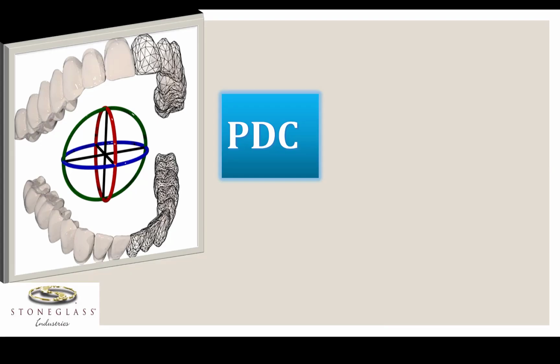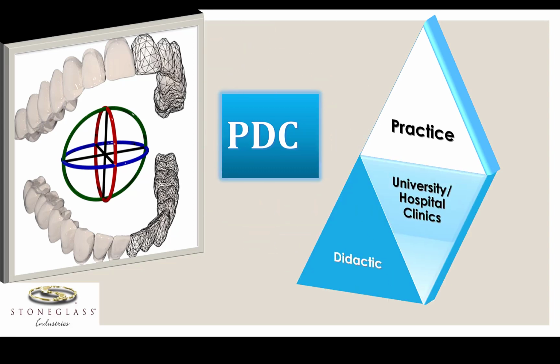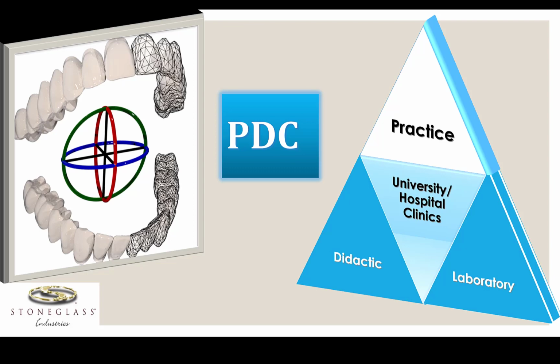In summary, what does this software offer? It is both a clinical and an educational tool that provides the ability to actively participate in as much of the prosthetic design process as desired. It can be part of a foundational curriculum to build basic skills in the setting of teeth and festooning for partial and complete fixed and removable prostheses, as well as treatment planning. Art and science not only are combined, but they're optimized.